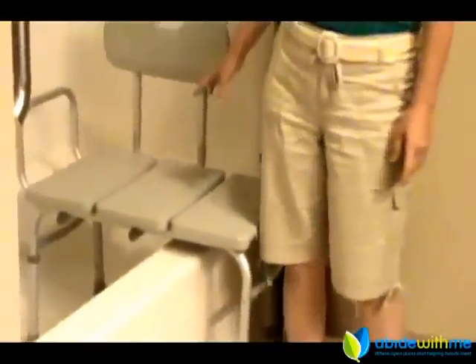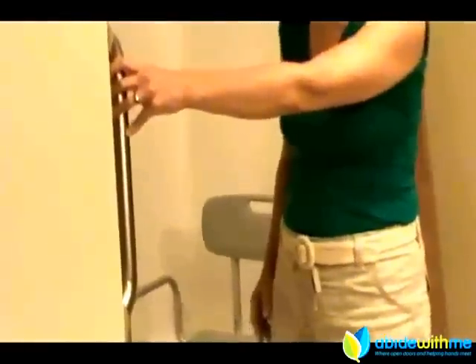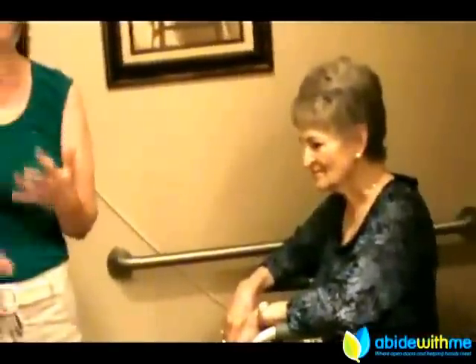Today I'm going to be showing you how to use a tub transfer bench in the bathroom. This is especially helpful if somebody's had a hip replacement or is weak and can't actually lift their leg up over the edge of the tub. Even with grab bars, sometimes that's kind of an unsafe position to be in.